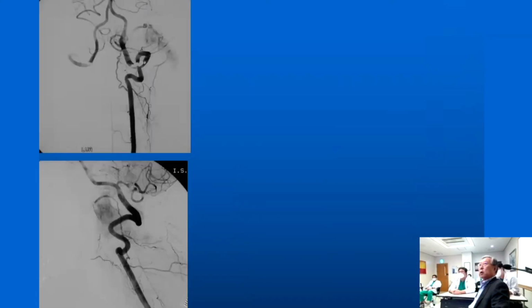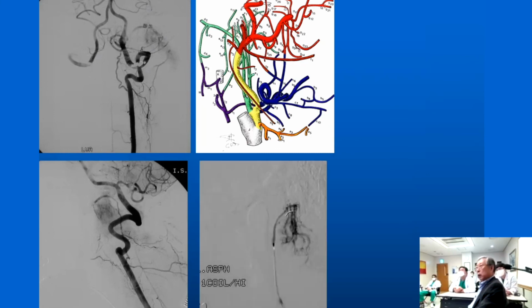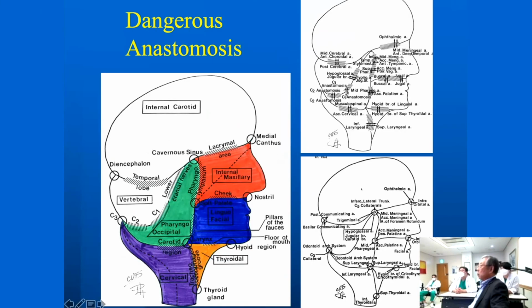If you look at this vertebral artery injection, we see this large vessel supplying a paraganglioma. This is what we have here: the ascending pharyngeal artery going back and filling the vertebral artery this way, the so-called odontoid process arterial arcade. That also gives a very important collateral from vertebral to external, same as the occipital artery. This is written in that textbook, right? So find it and see what types of collaterals exist.